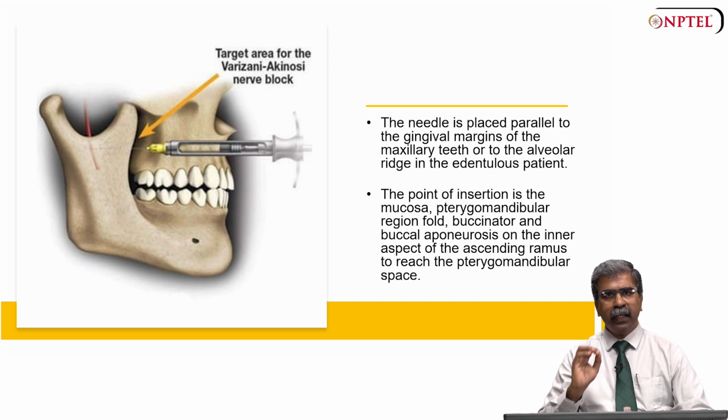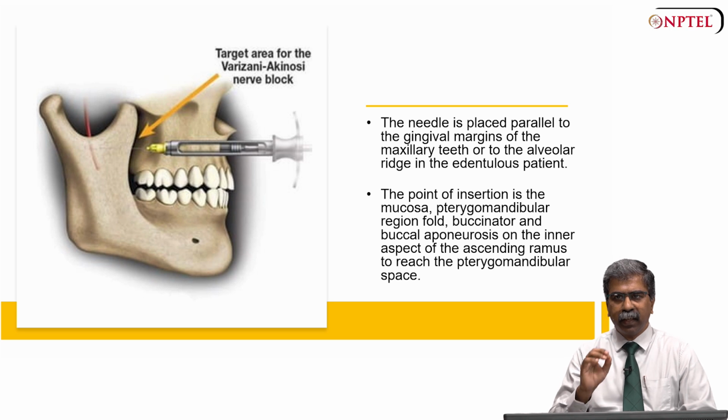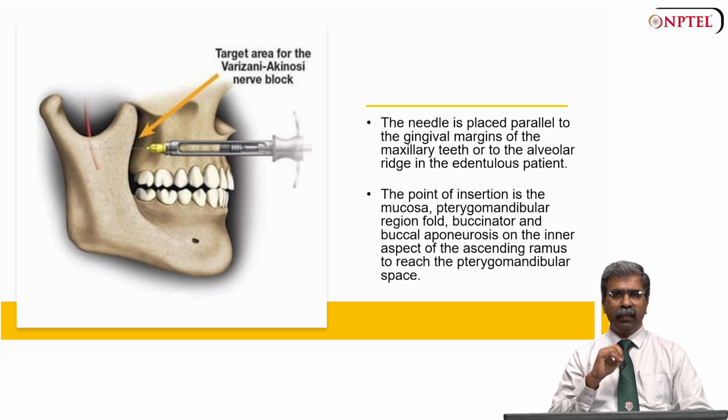By targeting this specific area, the needle can effectively reach the pterygomandibular space where the inferior alveolar nerve and the other branches are located, facilitating successful anesthesia for procedures involving the mandible.